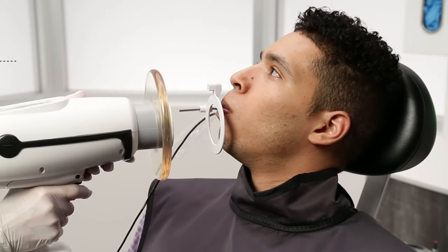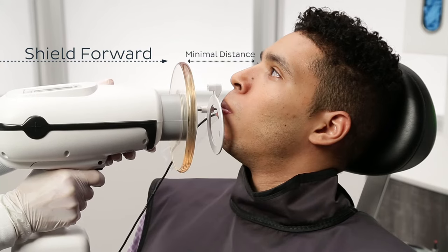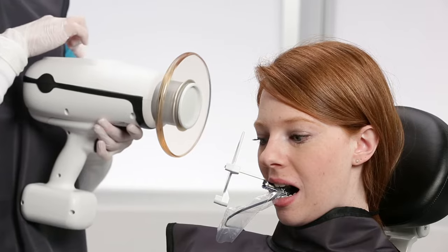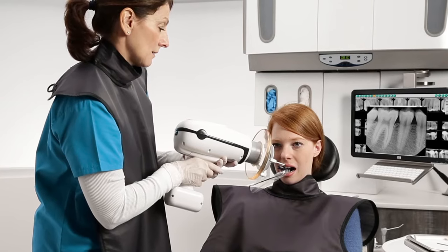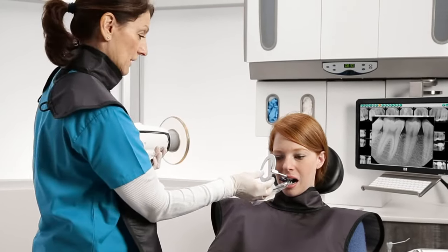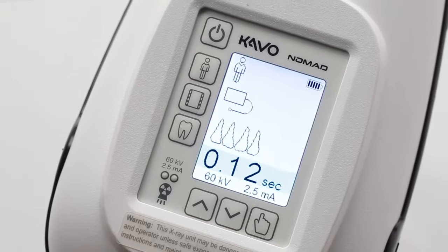Ensure the shield is all the way forward on the collimator and hold the unit as close to the patient as possible when exposing an image. If you need to angle the Nomad or adjust the backscatter shield and cannot be completely within the protective zone, we recommend you wear a lead apron. It is recommended that even when wearing a lead apron, keep your elbows close to your body when operating the device.